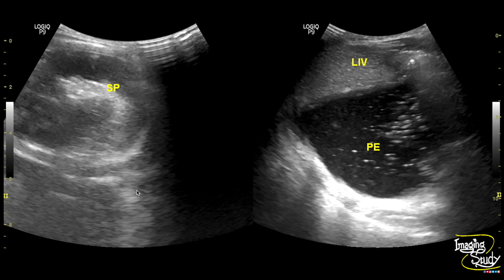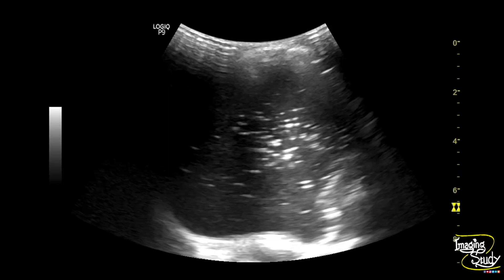There is no pleural effusion on the left. Here again is the thick collection. It is not completely anechoic; rather it is hypoechoic with echogenic foci.